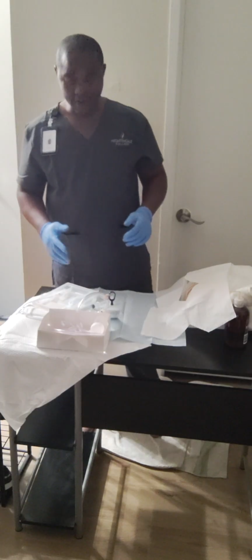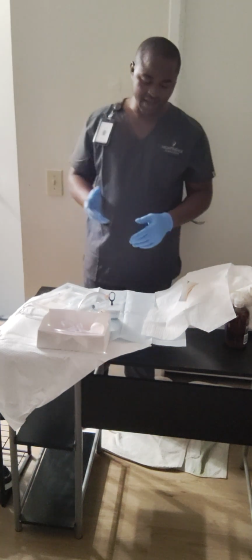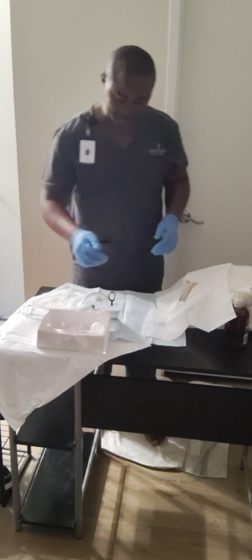Okay, now that I have the tip of my catheter in the loop and my syringe is set, I'll go ahead and tell my patient I'm about to start cleaning them. They should be calm and I will take care of them.